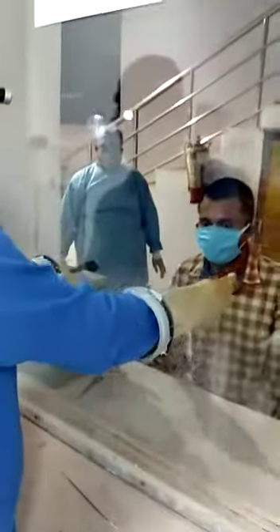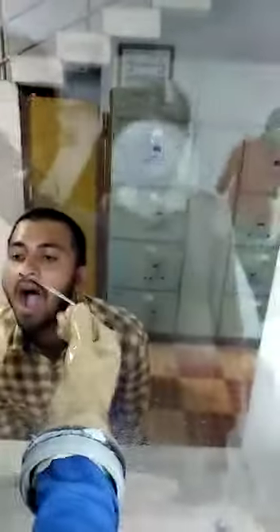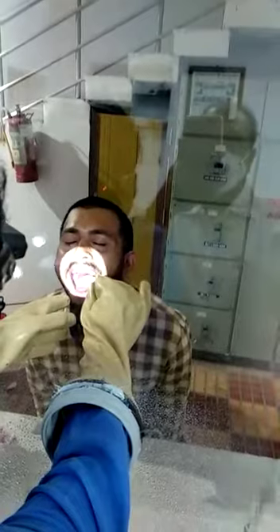The doctor is inserting the hands again through the glass pane. He has taken the swab, removing it, taking it out. That is the swab with which the sample is taken from the throat. That is the time when the patient is prone to cough, and that is when the glass pane helps in protecting the doctor.